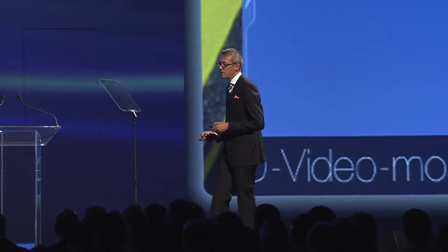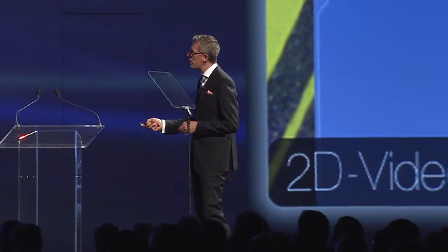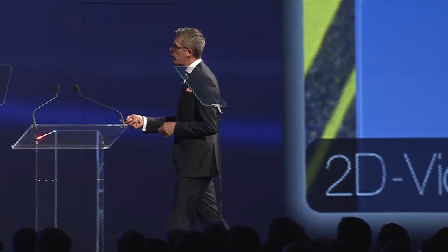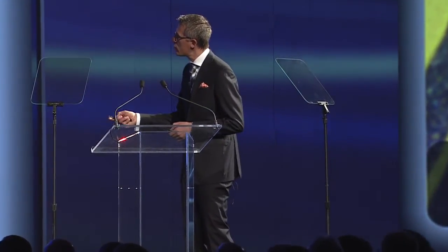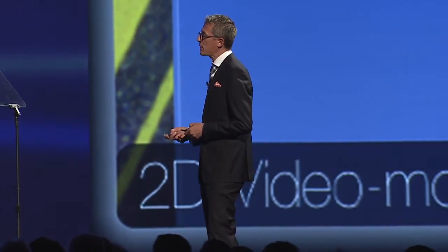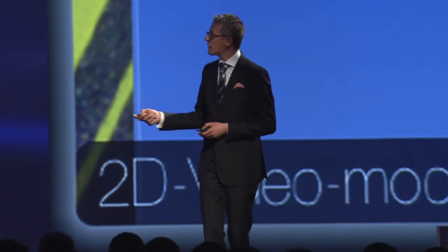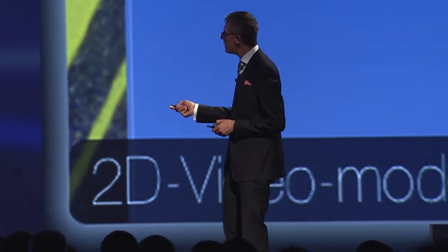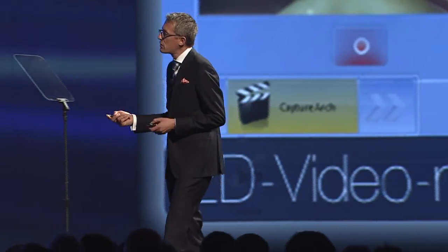And as the previous presenters have already mentioned, we can use a so-called two-dimensional video tool. Normally, when we are scanning our cavities, we do this with the Measure 3D tool to get the 3D information to design a workpiece. But we can also use our OmniCam camera in this two-dimensional video mode for patient communication. So we can switch from Measure 3D to Video 2D, and then we can make a small video clip.